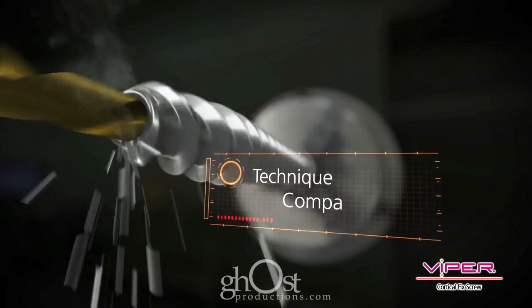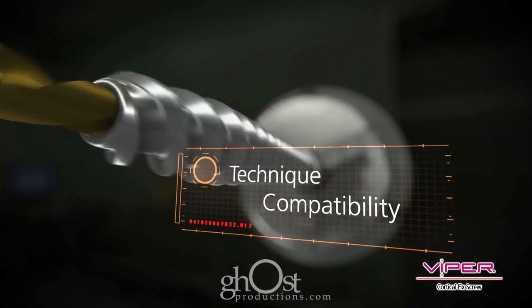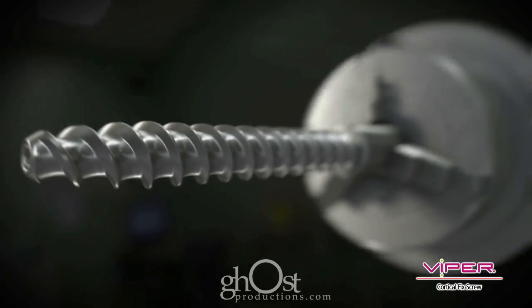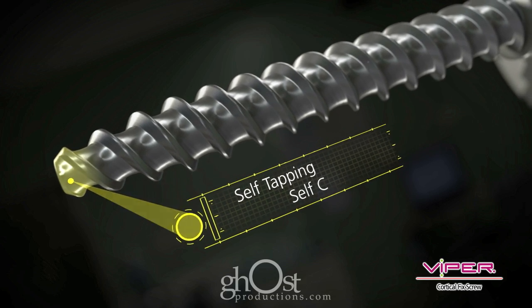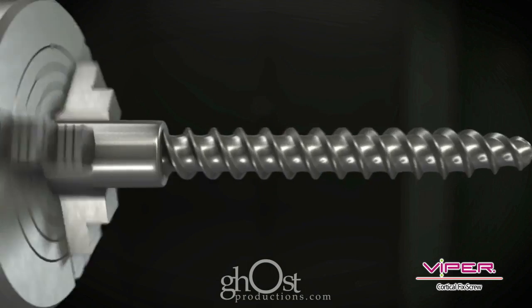All Cortical Fix screws are fully cannulated for open or MIS use with the Expedium and Viper systems. The screw tip is self-tapping and self-centering for insertion with or without tapping.